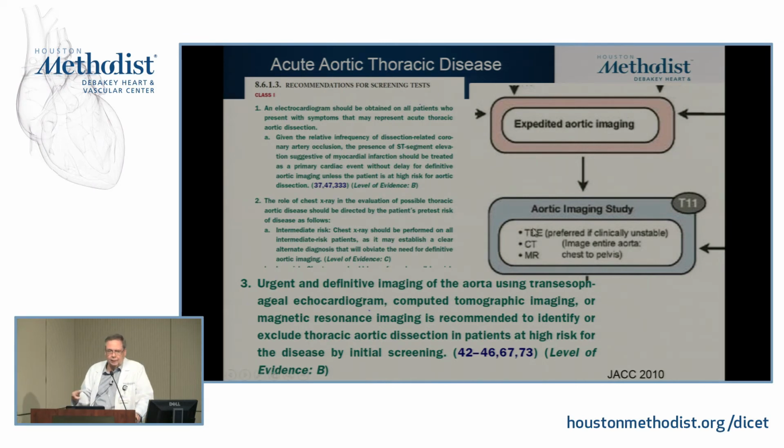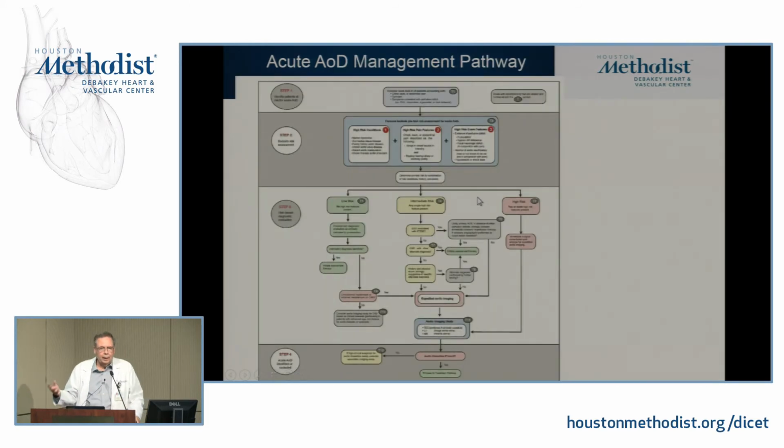You can do it anywhere, in the ICU, any place, and many years back, we did a lot of them before we had the quality of CT and CMR that we have today. They always talk about CMR being perhaps more for the stable patient that has a little bit more time. But again, you heard FAISAL talk about the fact that you can actually do a down and dirty very quick MR too. So these things vary, and they're going to vary a lot in terms of where you end up doing your practice.